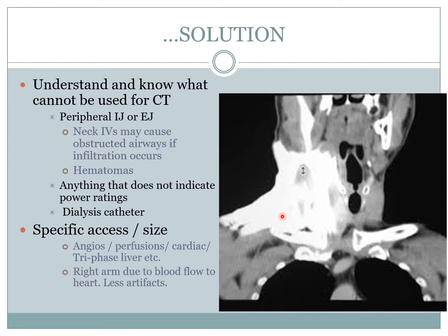Here in California, and I'm sure in the rest of the states, we do not use it because, one, it's against the law. Our license can be taken away. And this is because of this reason. So this, again, is contrast. Just like the arm that we saw earlier, that was contrast infiltrated in the arm. Now this is contrast infiltrated in the neck. So if contrast is going in the neck, it's just going in, going in, going in.